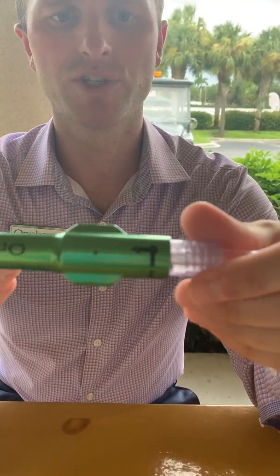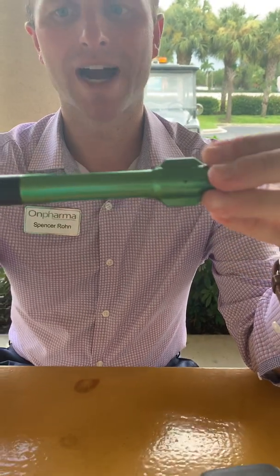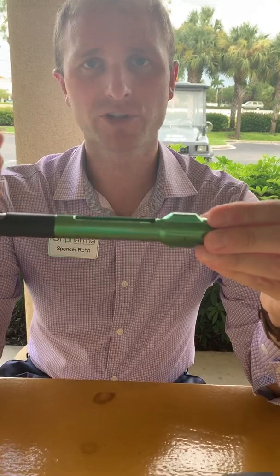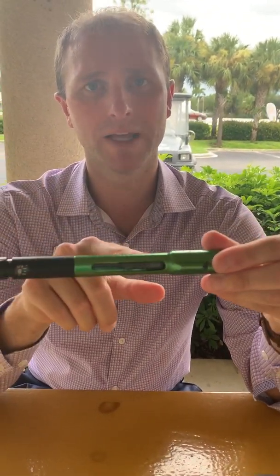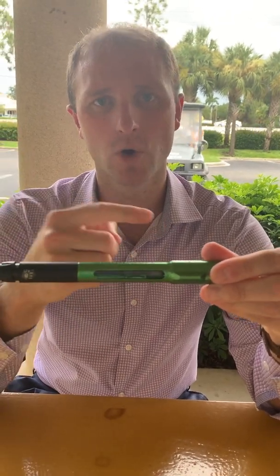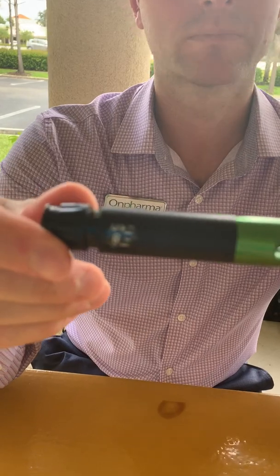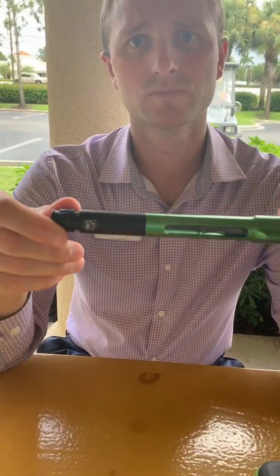I see. So what you do is you twist, you push in, and you dial this to 9, which measures precisely the amount of sodium bicarbonate that you're injecting into the local anesthetic. Spencer, I'm going to zoom in on that 9. Now, if there's a 9 that we have to get to, why does it dial to other numbers?